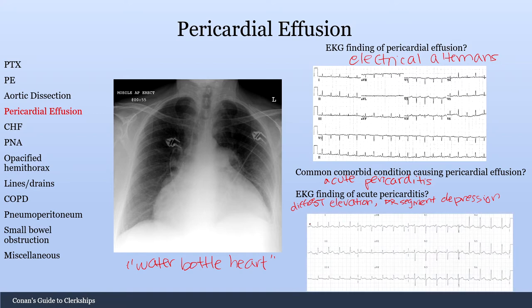Here is an EKG of acute pericarditis. You can see diffuse ST segment elevation throughout. More indicative — though it might be a little small on your screen — are the PR segment depressions seen throughout as well, especially in lead 2.